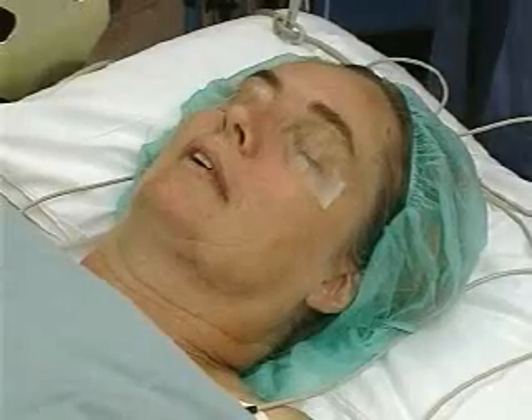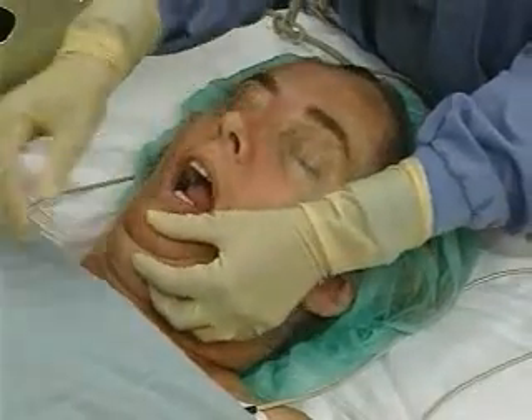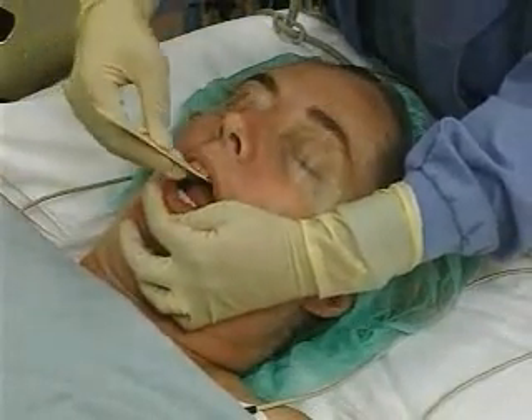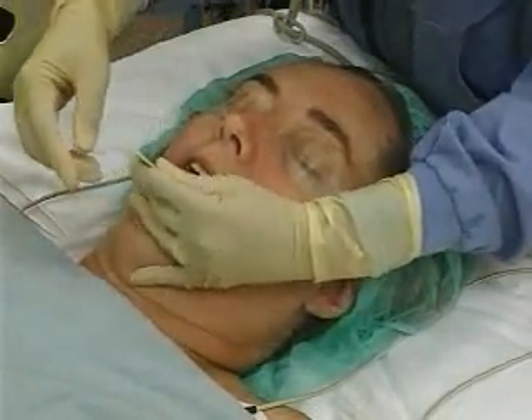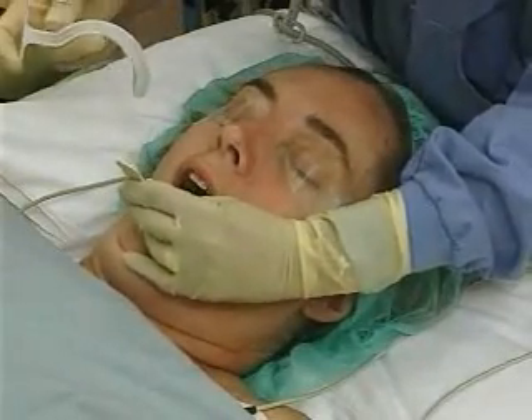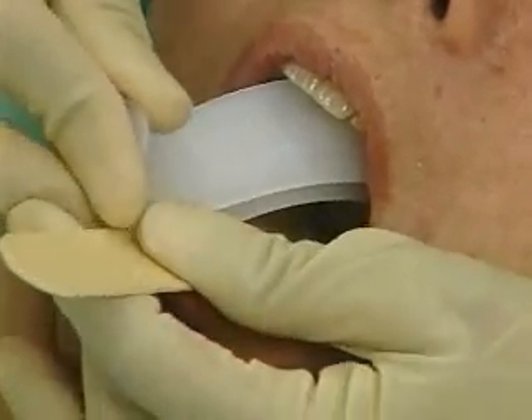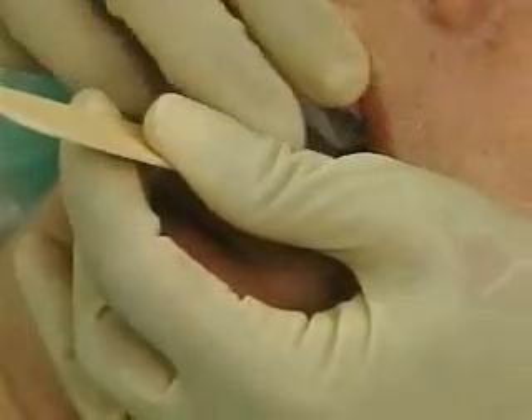Patient positioning should be supine or lateral. Open the patient's mouth and place the tongue blade at the base of the tongue. Draw the tongue anteriorly to lift it off the pharynx. Place the airway in the mouth with the concave side facing down so that the distal end is approximating but not touching the posterior wall of the oral pharynx.